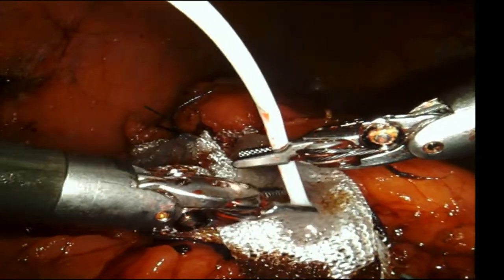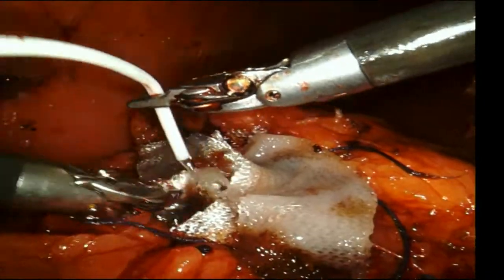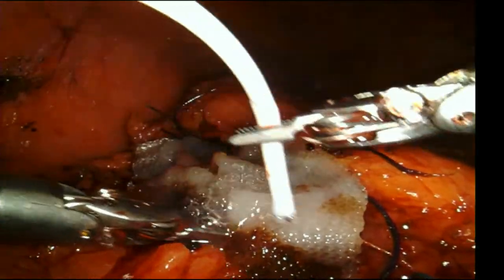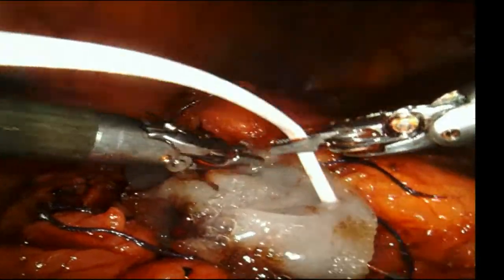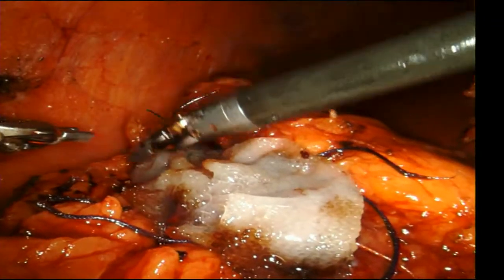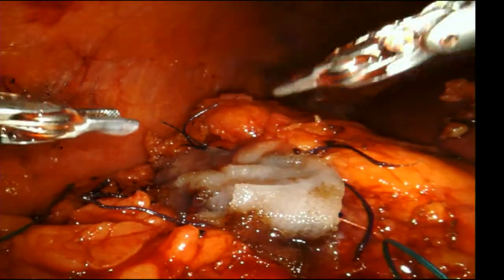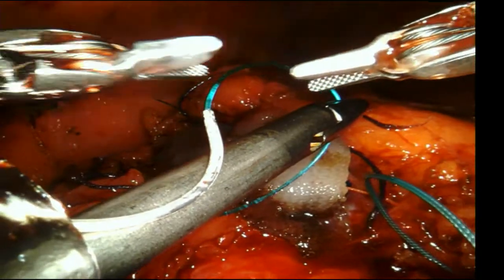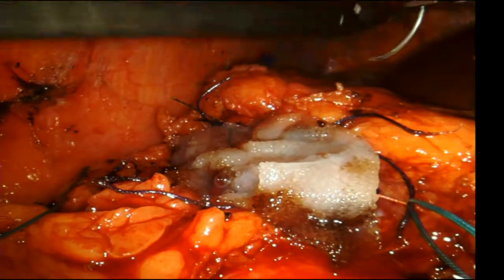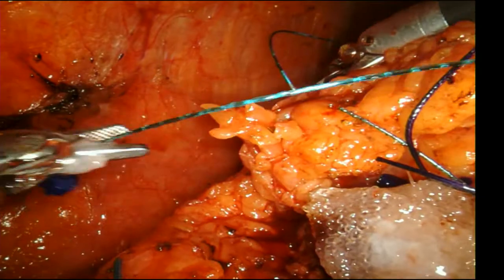We wrote a couple years ago the paper in Journal of Urology of avoiding drains in robotic partial nephrectomy, and the editorial was pretty scathing. So I invite people to go back and look at that, just to get a look at what the predominant feeling was at the time about this dogma of using drains on partial nephrectomy. And I think the pendulum has really shifted now. I think the majority of people are getting away from using drains, just very selectively using them. And as you get more experienced, you get more comfortable not using the drain. Same thing with pyeloplasties.